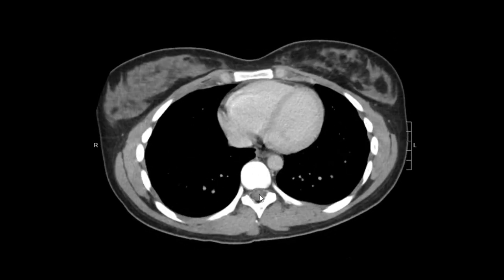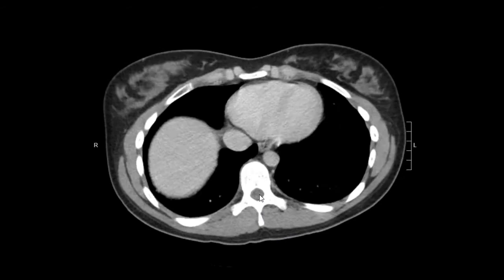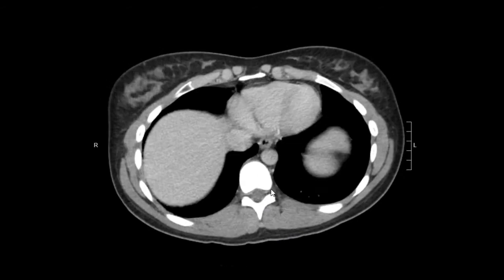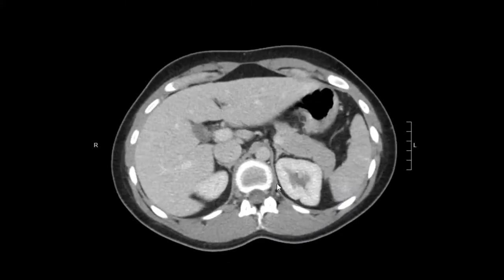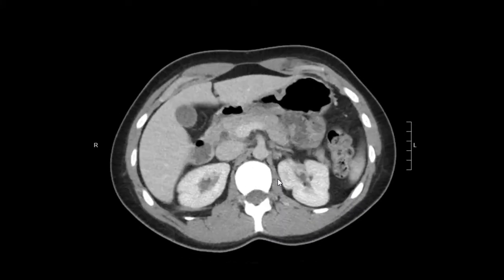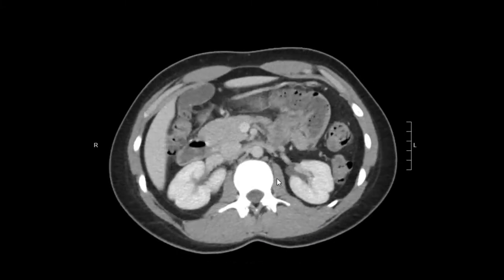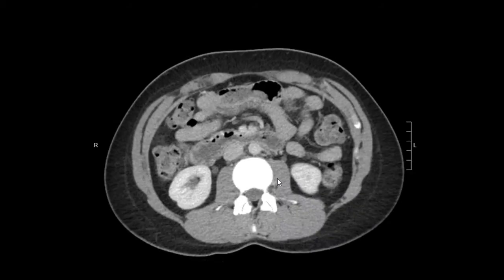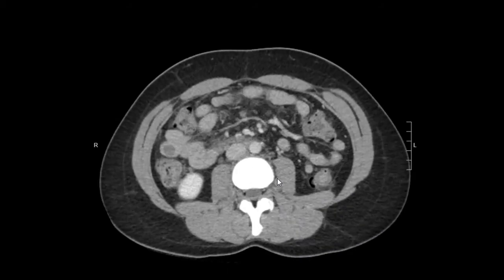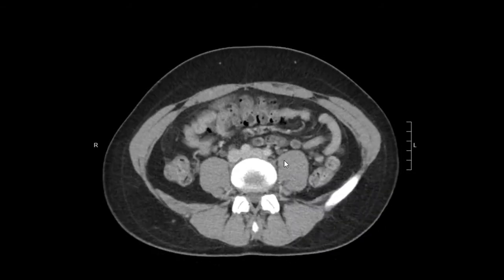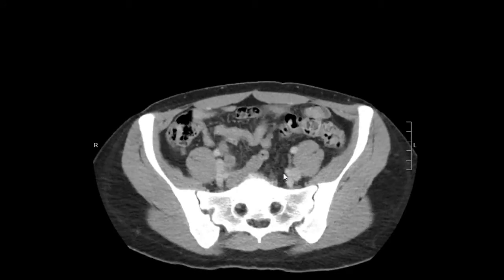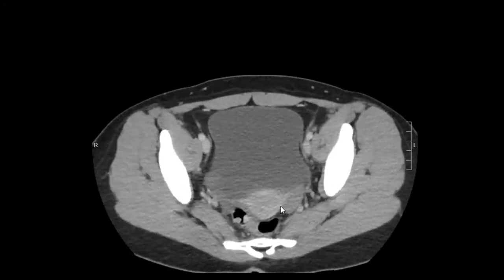Lastly, we're going to look through the spinal canal and the neuroforamina — the right and left neuroforamina. There's no obvious spinal canal narrowing or spinal cord mass, and that all looks good.